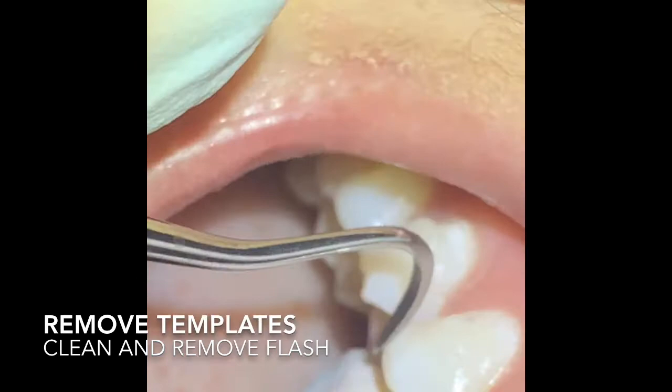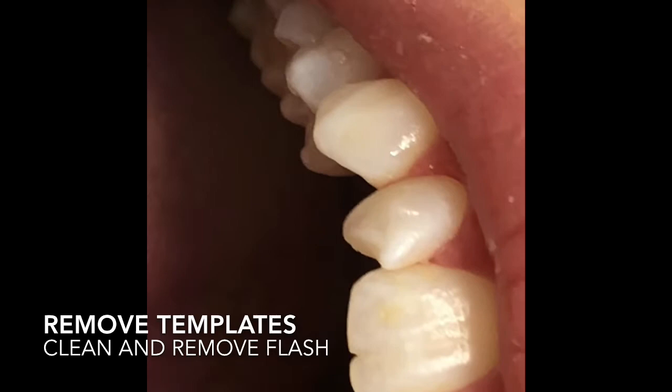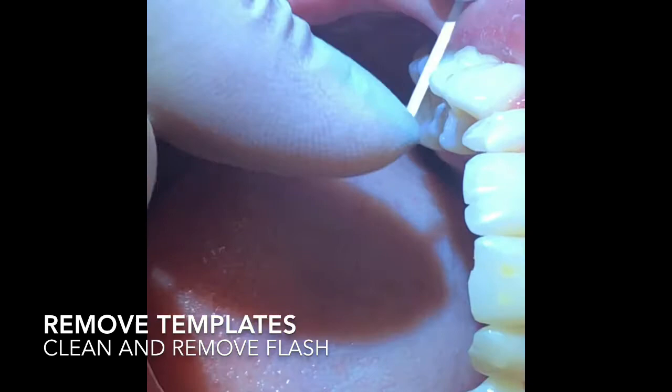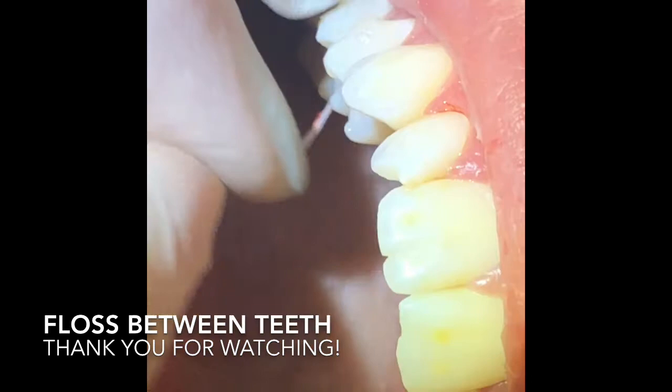Dentists, make sure you always check this when you seat the first aligner - removing flash is very important. Also make sure you don't close the contacts. Floss between every contact because sometimes bond gets in between there. Jennifer, your teeth aren't going to feel the same for about six months. Check all contacts. Good work!